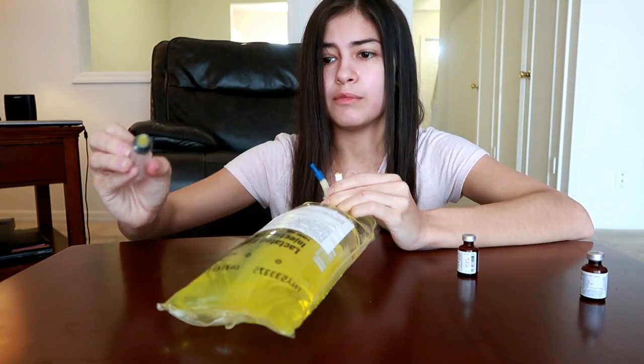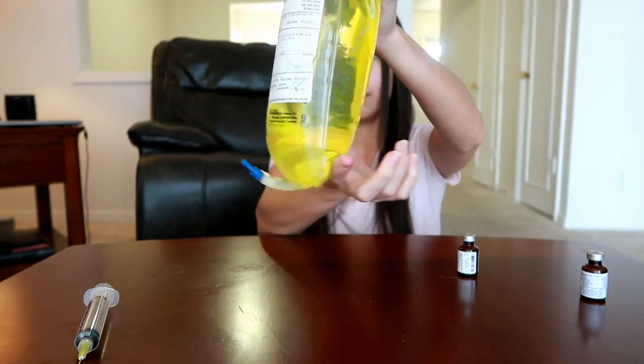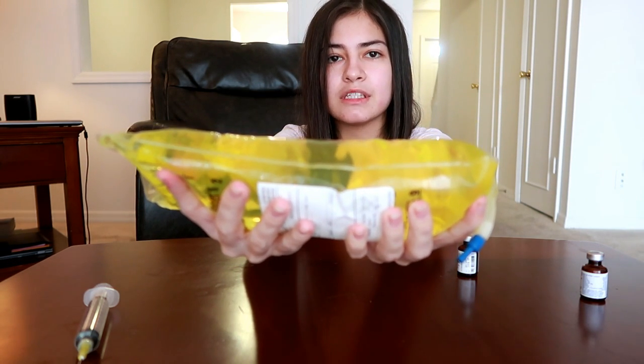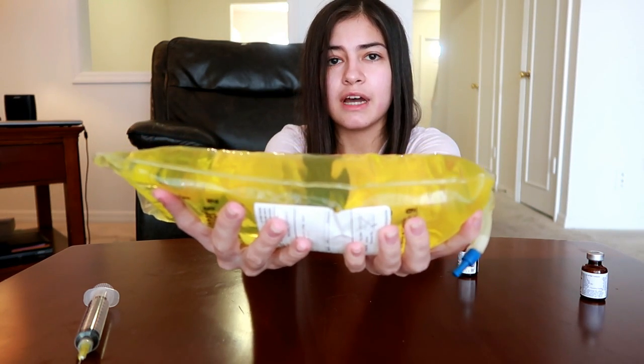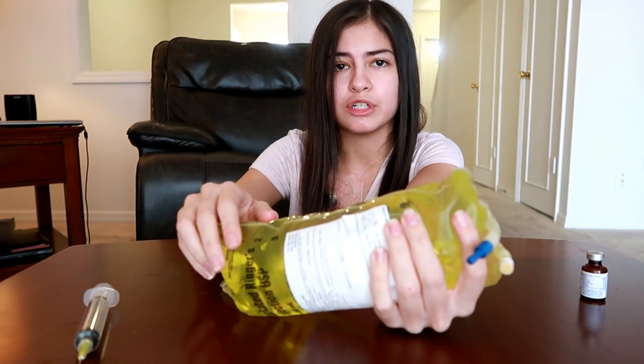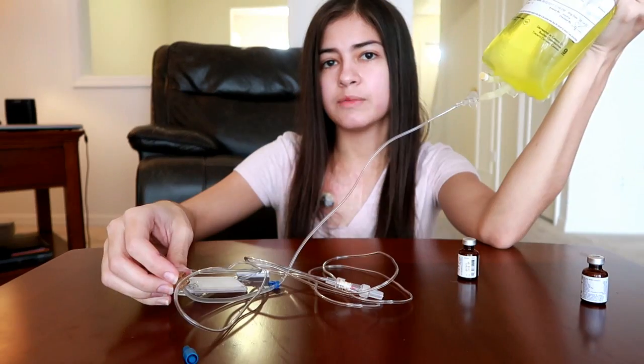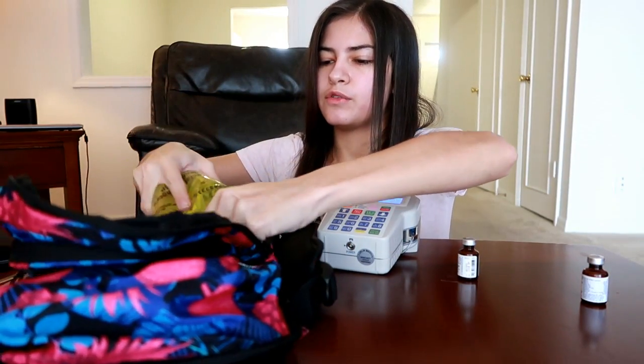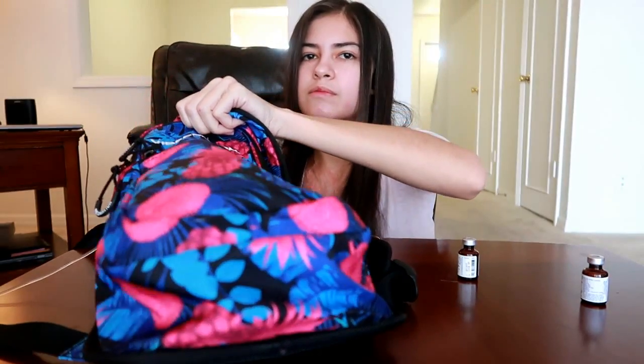The syringe will go in the sharps container. I mix a few more times and you can see it turned yellow — that's why they call it a banana bag, because of the color. Now it has a lot of vitamins and nutrients, and this should really help me feel better since I'm barely eating 500 calories a day and just really lacking nutrition. I prime the tubing to get all the air out, the infusion bag goes into my infusion backpack, the pump goes in the backpack, tubing goes in, and I am all good to go. The banana bag feels just like a normal lactated Ringer's or saline infusion — it doesn't feel any different, but it's hopefully going to make me feel better because of the added sugar, nutrients, and vitamins.